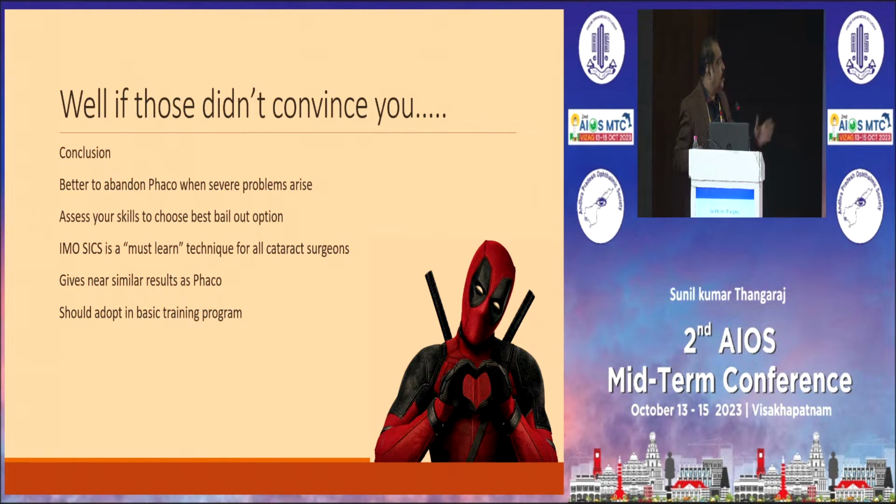So basically, this is my conclusion. Whenever you are in a tough situation, it's better to abandon phaco because phaco is pretty unforgiving. Assess your skills, choose a proper bailout option. In my opinion, SICS is a must-learn technique. This is a presentation I'm supposed to be giving somewhere abroad, that's why I put that last one. Should adopt it in the basic training program.